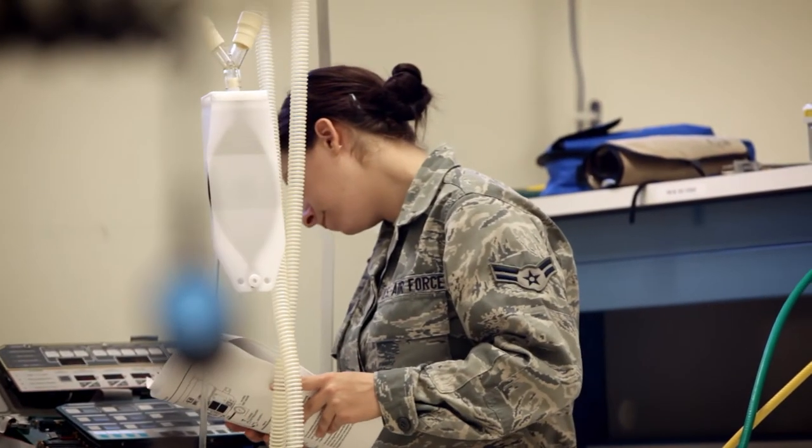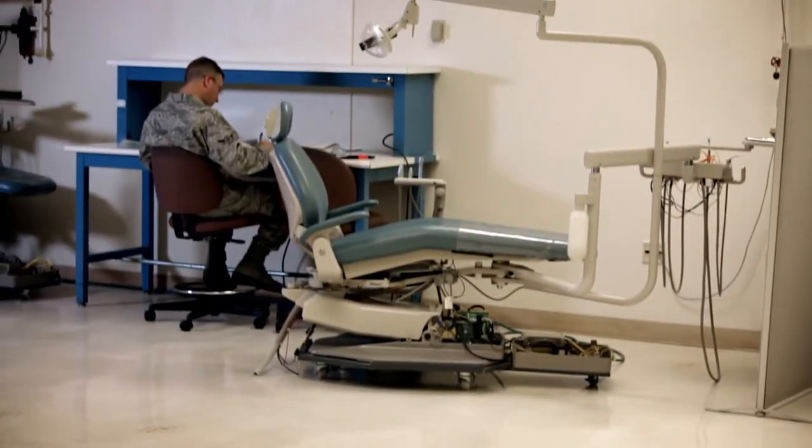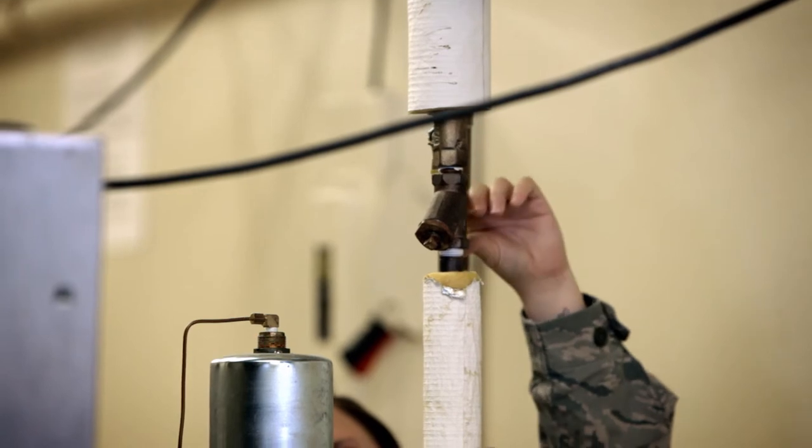Vital signs monitors, working into infant incubators, hypothermia units, dental chairs, anesthesia. Basically anything you can find in a hospital we fix.